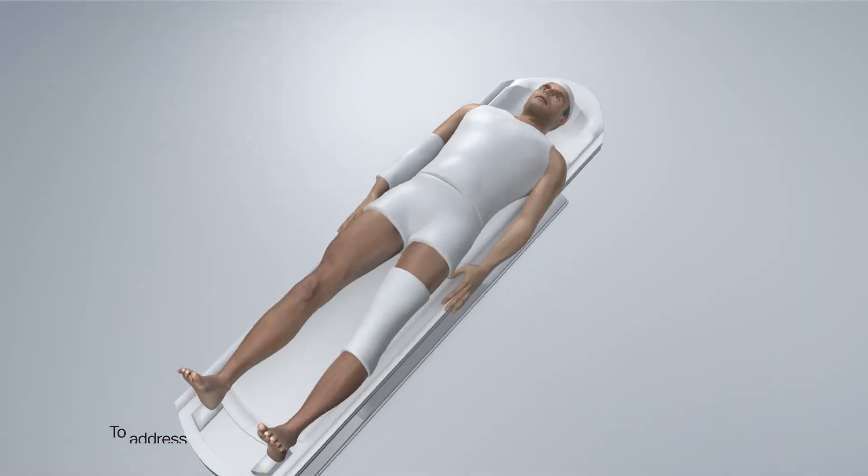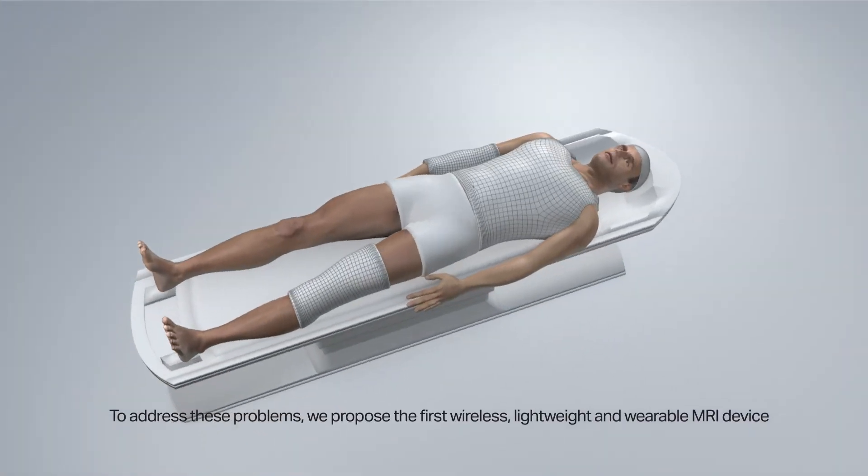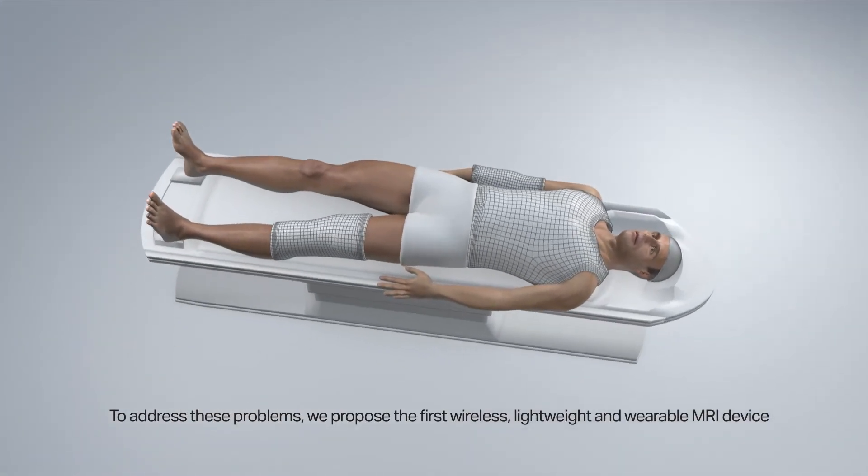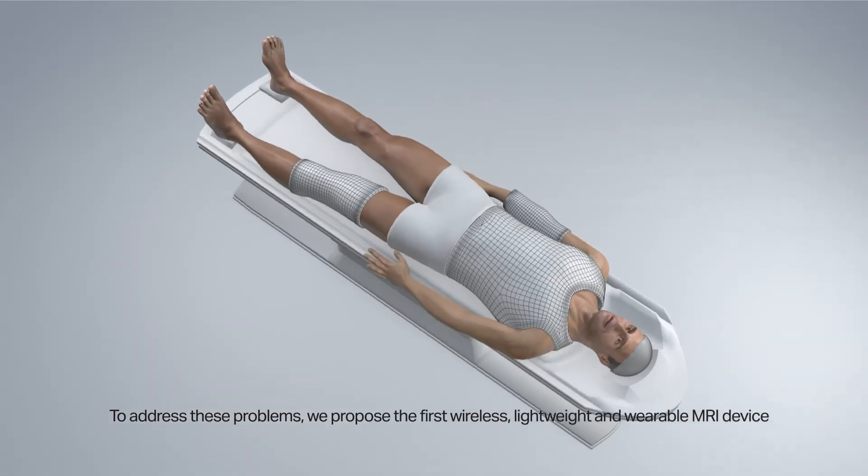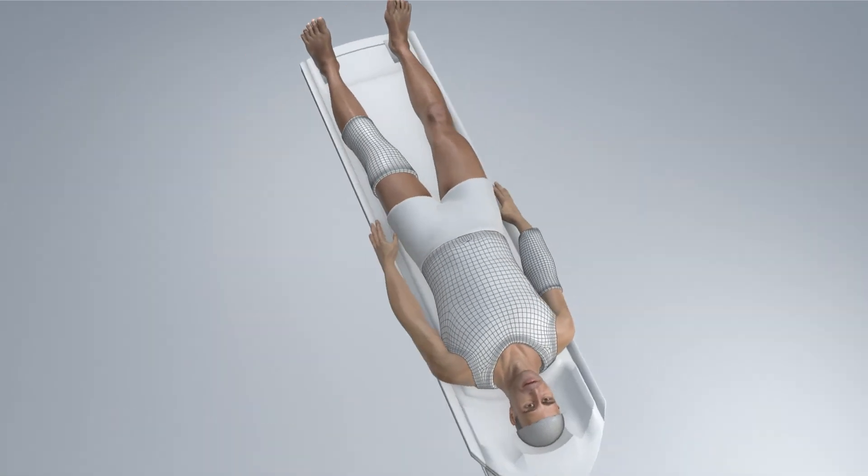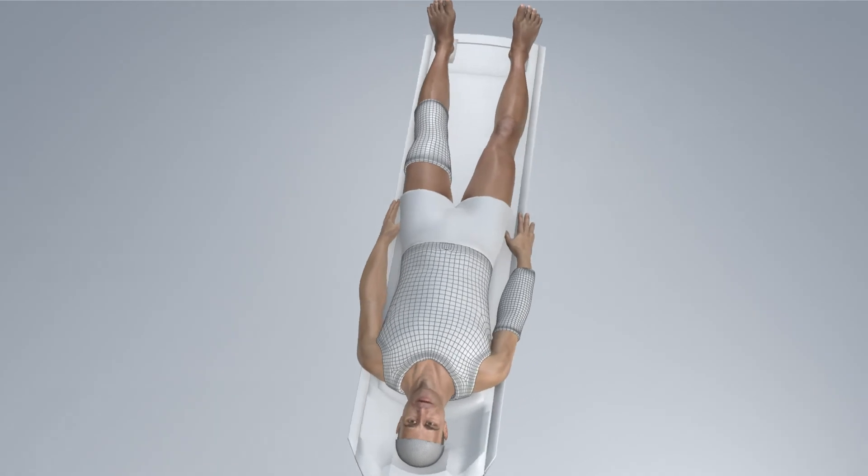To address these problems, we propose the first wireless, lightweight and wearable MRI device.